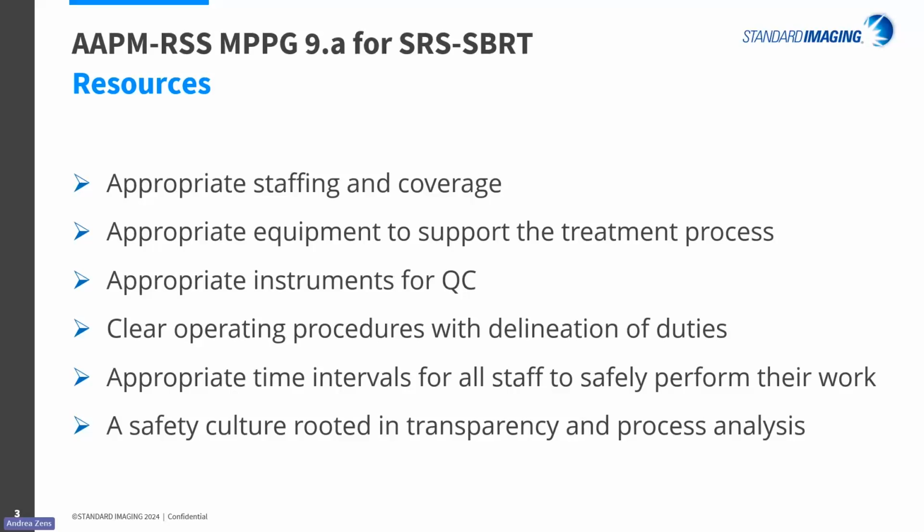These include enough properly trained and certified personnel, such as radiation oncologists, medical physicists, dosimetrists, and therapists, so as to provide enough time for all to safely perform their work. Appropriate equipment to support the treatment process. That'll be your LINAC, your imaging, your treatment planning, SGRT, and IGRT systems.